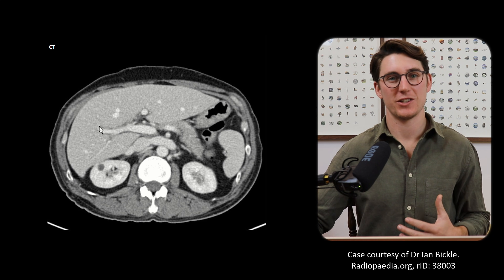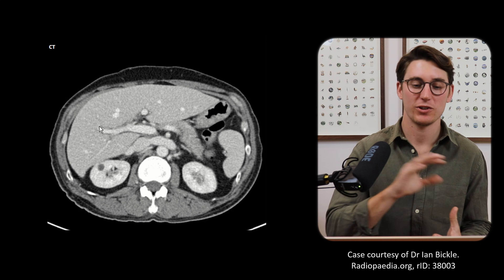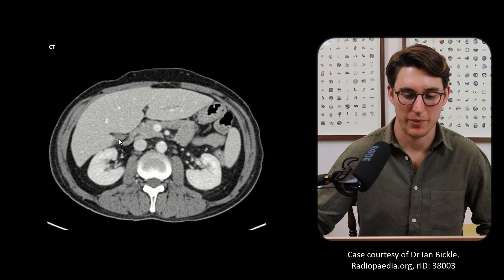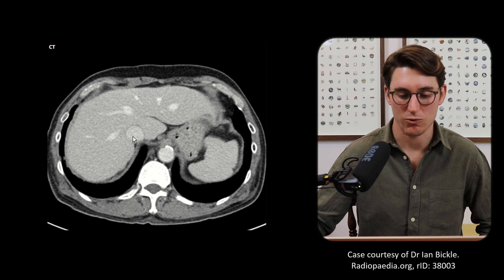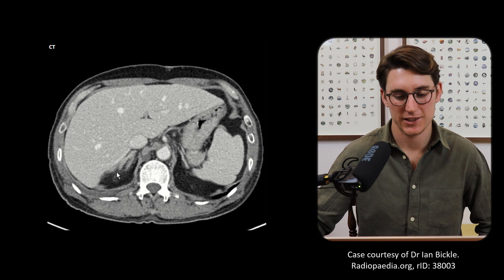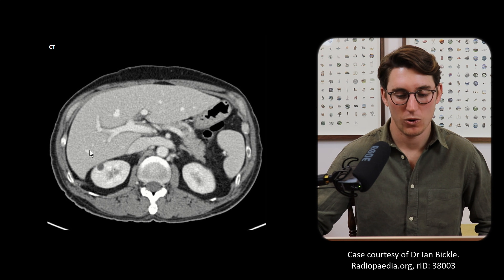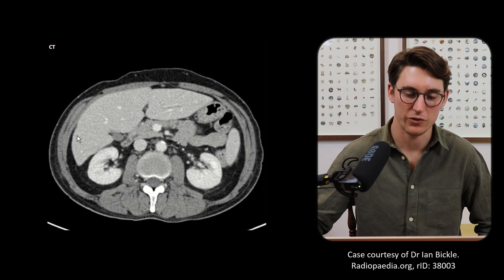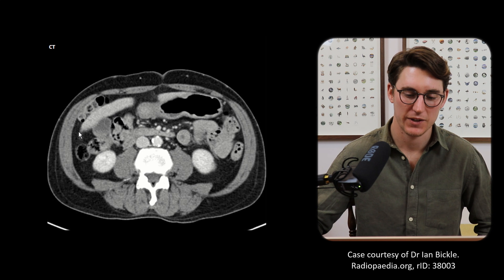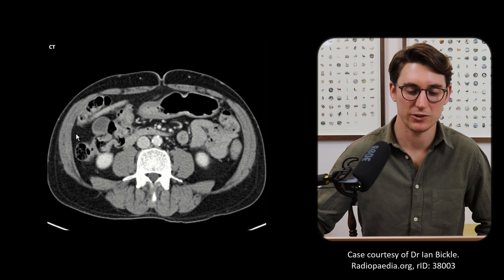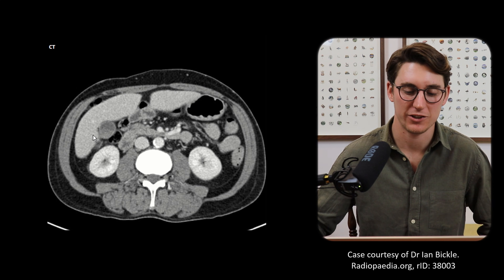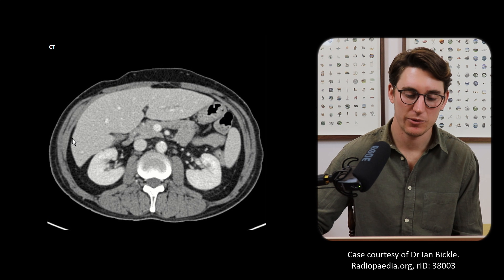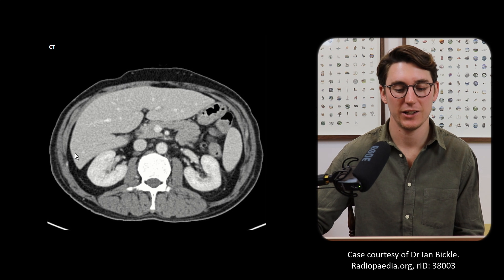Posterior to segment five, or around the corner laterally and posteriorly, is segment six. Going back up to the top, finding our right hepatic vein, we follow this segment down all the way until we can see our right portal vein. Inferior to our right portal vein, all of this is segment six coming down. Sometimes the segment can really dive down — that's called Riedel's lobe and that's a normal anatomical variant, so don't confuse that for hepatic hypertrophy. Posteriorly, that's segment six.